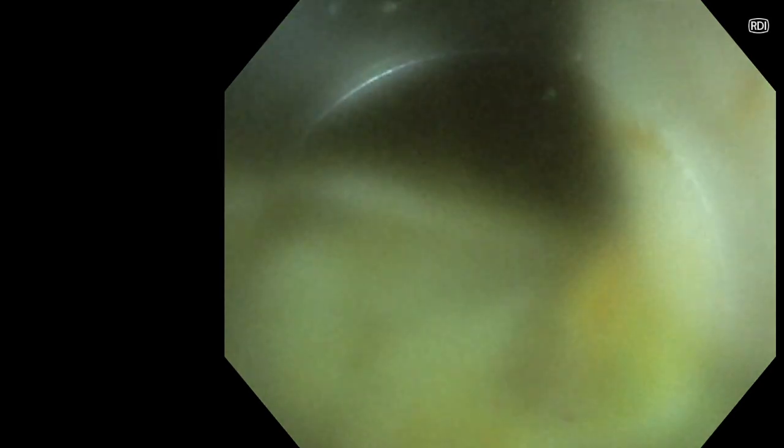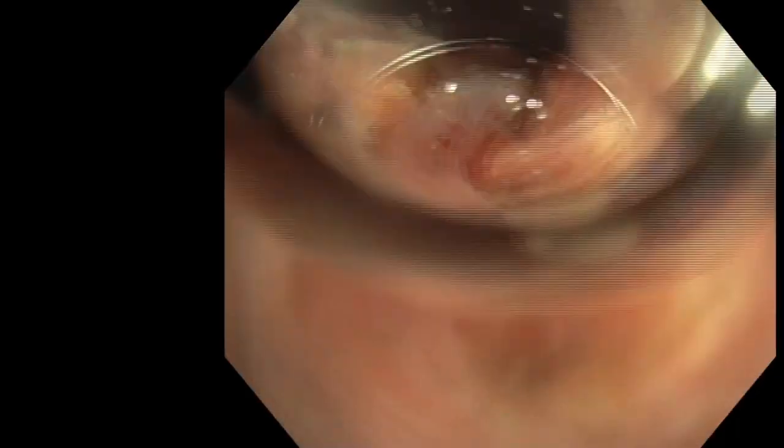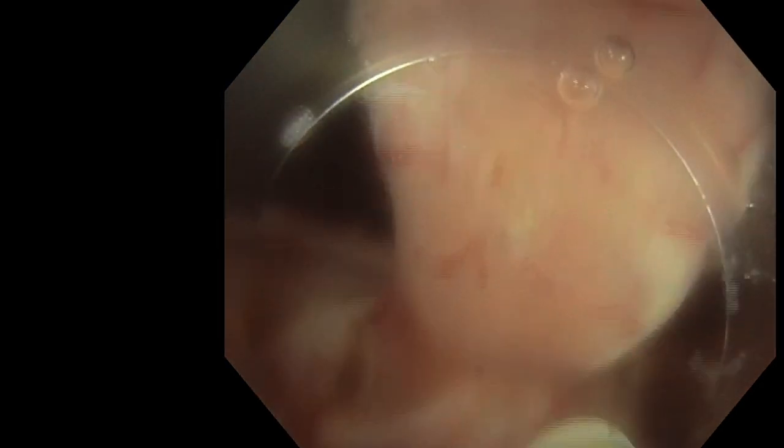But I like to use this mode because sometimes the window to find the bleeding is not very long and not very large, and sometimes you only have 1 second to see where the bleeding comes from. Thanks to RDI, sometimes you see where the bleeding point is.